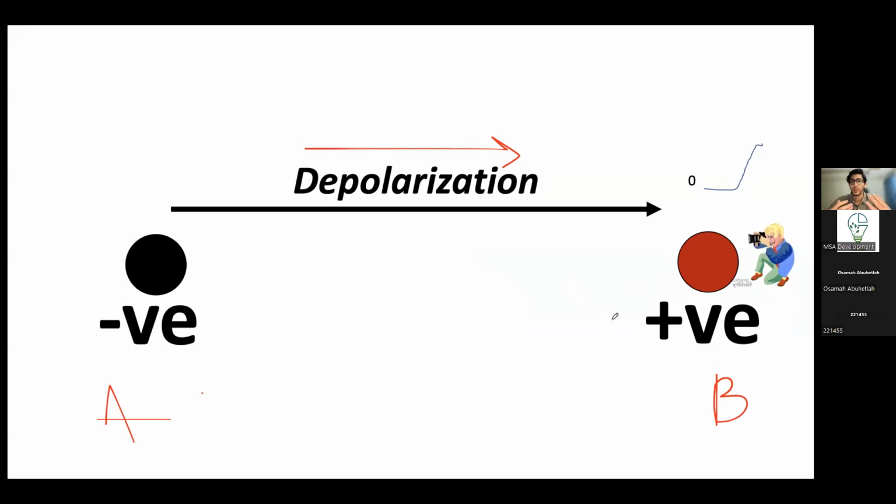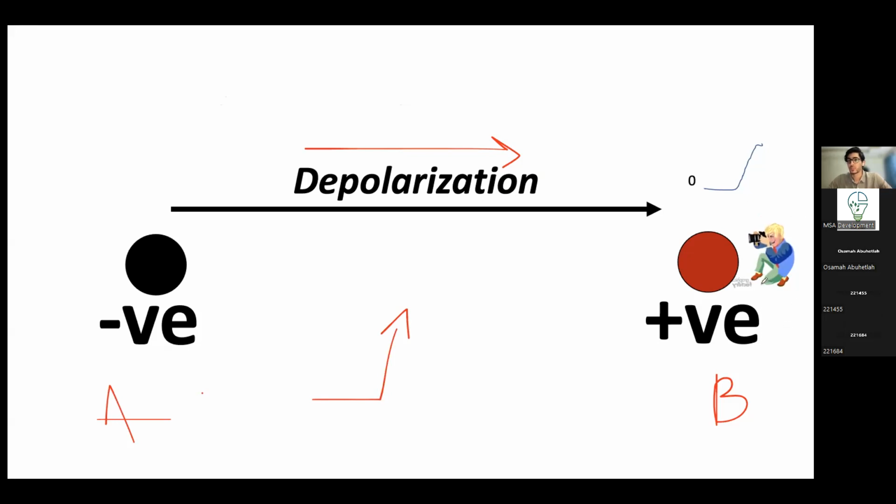So if I have an ECG, logically speaking, where is the deflection going to be, up or down? We have a wave of depolarization that's spreading towards the positive electrode based on what we've learned so far. So the deflection is going to go up, right? It's going to go up. And so I put this guy right here just to show you that the positive electrodes are what are going to record the actual electrical activities of the heart. So we really worry mainly about the positive electrodes when we discuss the physiology behind the ECG. So mainly focus on the positive electrodes and where they are attached.